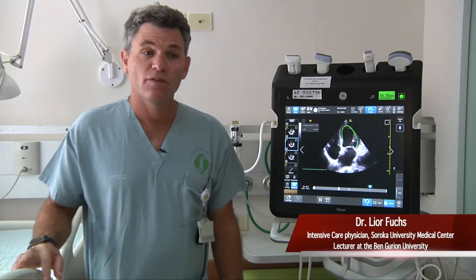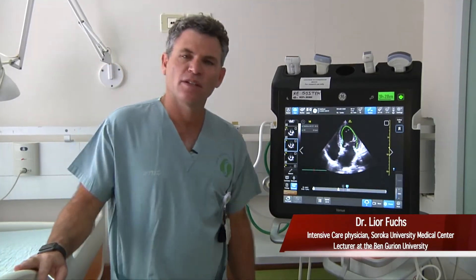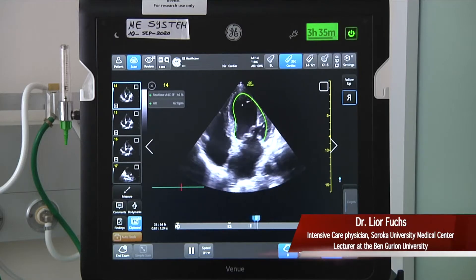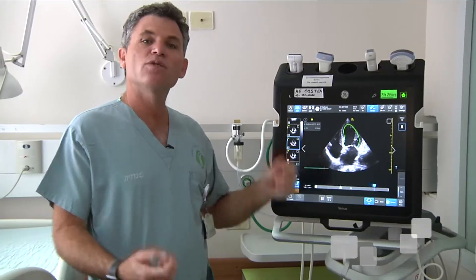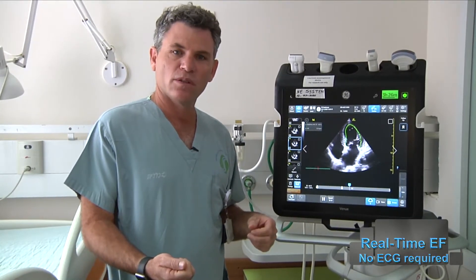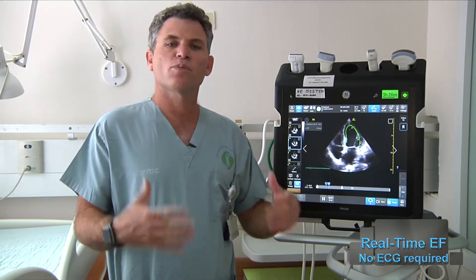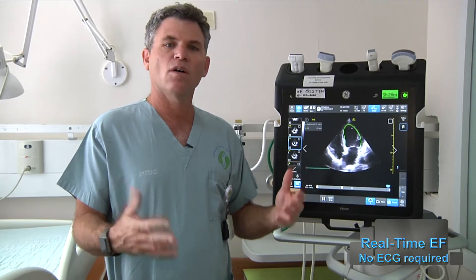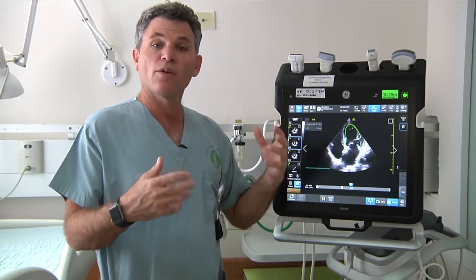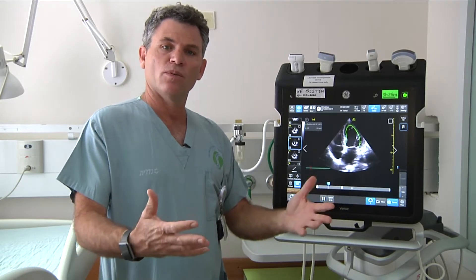The real-time EF is very helpful at the bedside. The fact that we get a number as we scan is very important. We don't have to do post-processing of the apical 4, but rather we get the number as we go.